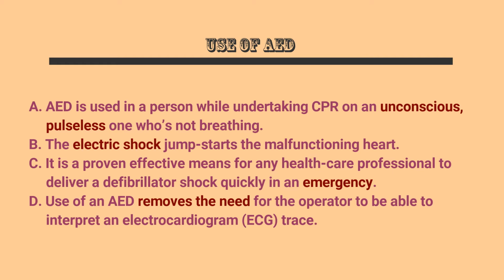An AED is used on a person while undertaking CPR on someone who is unconscious, pulseless, and not breathing. The electric shock jump-starts the malfunctioning heart. It is proven to be effective for any healthcare professional to deliver a defibrillator shock quickly in emergency cases. An AED removes the need for an operator to interpret an electrocardiogram trace.